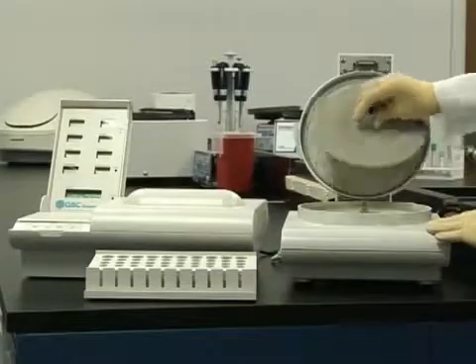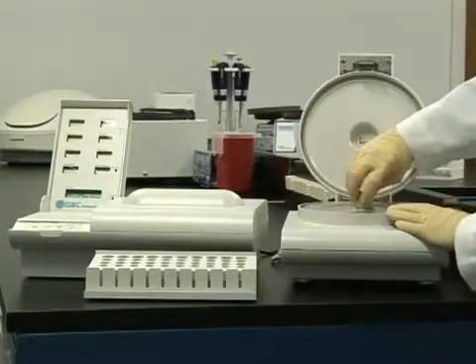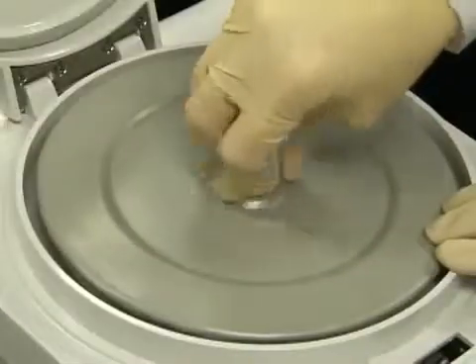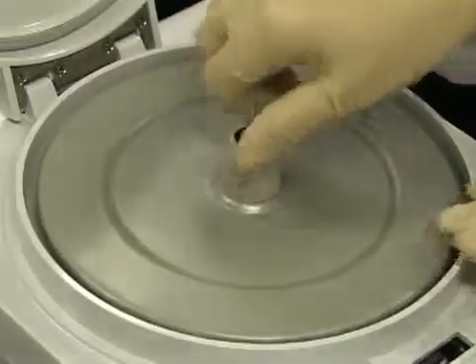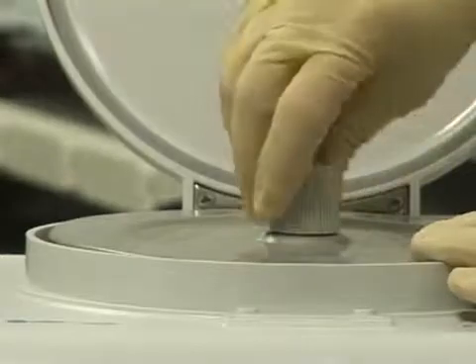Once the accutubes are loaded, replace the rotor cover. The rotor cover must be tightened carefully. If it is not secure, the accutubes could break. If tightened too much, the rotor cover could strip. Use approximately 6 turns for an appropriate fit.